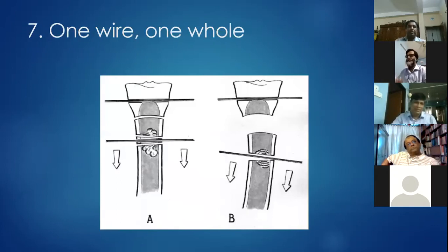And rule number 7, the last rule: one wire, one hole. Each wire drilled through the bone must be introduced correctly at the first attempt. Multiple holes resulting from incorrect wire positioning destroy compact bone through mechanical damage and through burning, and this destruction can result in weakening of wire fixation. Multiple drilling through the bone marrow significantly destroys its blood circulation, causing hematoma formation, delaying its ability for new cell development, and may even contribute to infection.